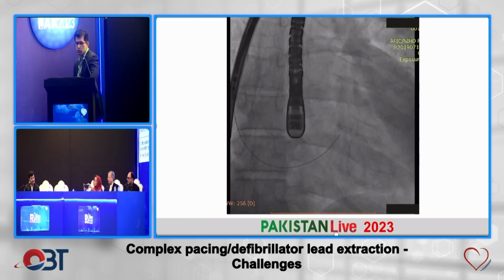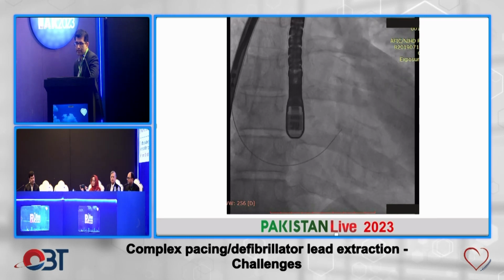Afterwards, of course, usually what we do in this patient is that once a device is removed, we reassess the indication for that device. Because this device was not implanted at our center, if the initial indication was valid, after waiting roughly 1 to 2 weeks, when the lesion heals, we reimplant the device, usually on the contralateral side.